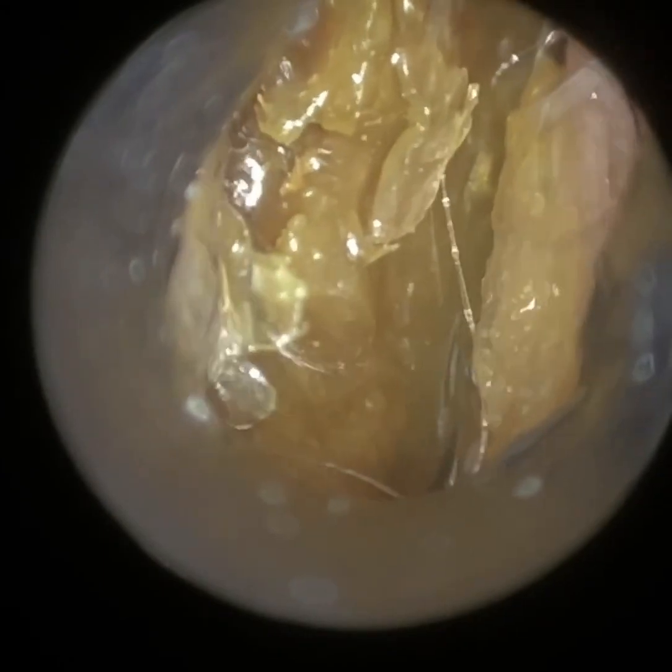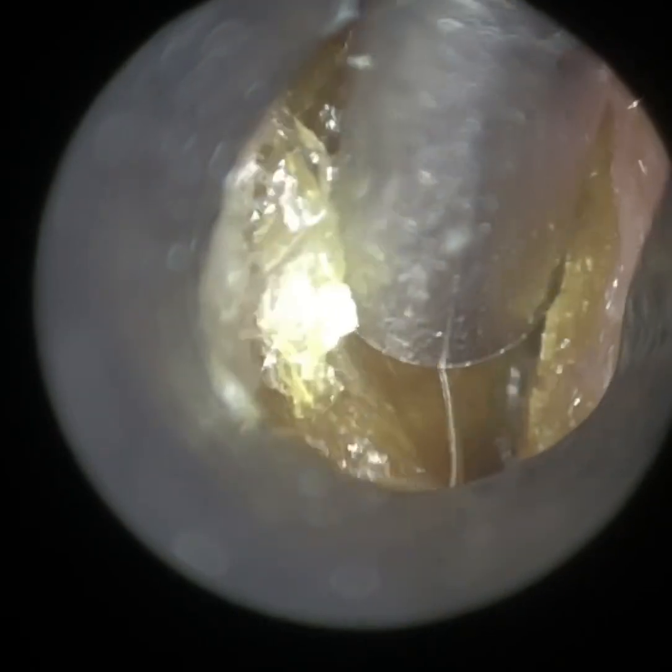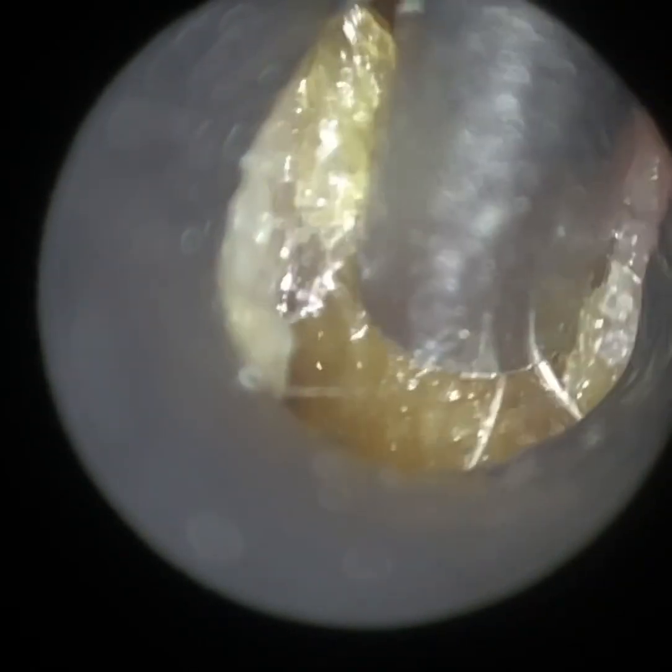So we had a patient who attended with bilateral, fully occluding, dry, hardened earwax and dead skin. This is the patient's right ear — this is the narrow ear of the two. I actually performed the procedure in the left ear first, but because this ear was narrow and a bit more interesting, I decided to swap the order around.